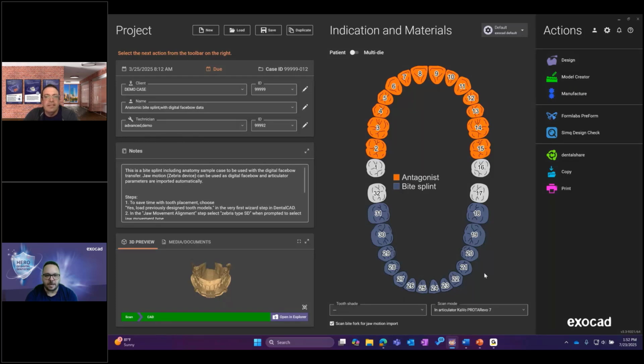I haven't heard any announcements internally that we'll be distributing a prototype as well, but it's very far along. Yeah, there is a reference to partial CAD 3.3 in the release notes for this public prototype of dental CAD, so it is in the works. So hopefully it'll be timed around the same time, so we'll see.